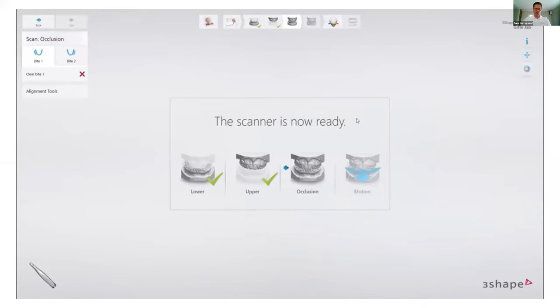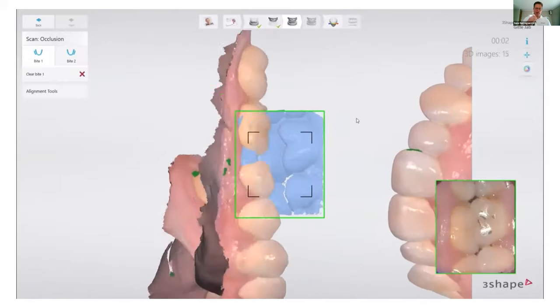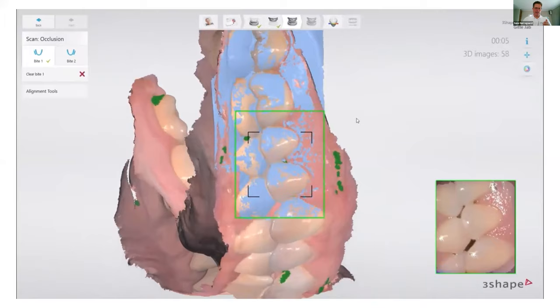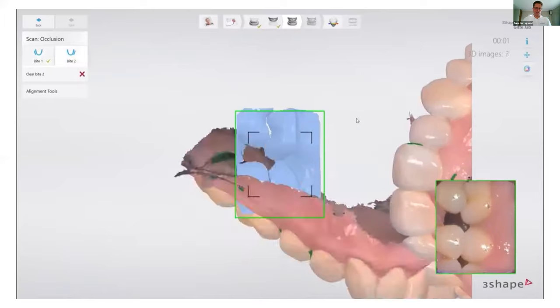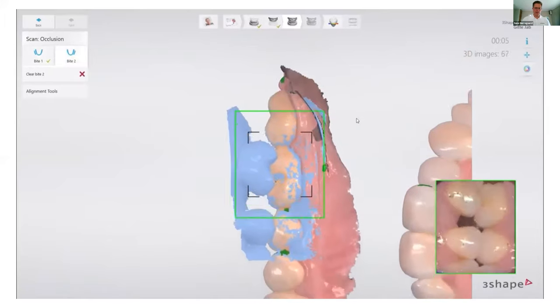And then we move on to the bite registration or the occlusion. It's simply done by putting the scanner into the mouth, asking the patient to bite together, and then scanning some of the areas that we already did. So we start by scanning the molars, we move it a little bit back, and then you continue until the canine in the front. And then the software will align the two scans, upper and lower, together.